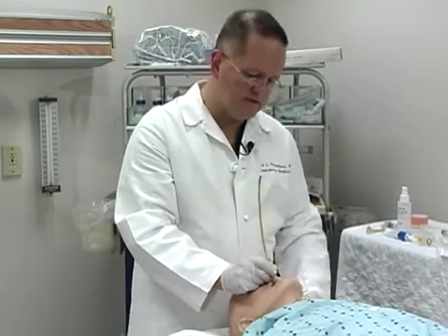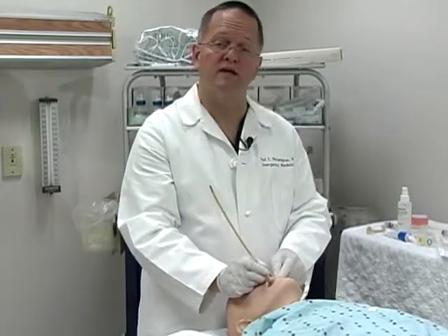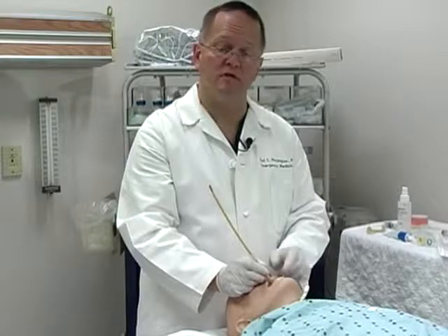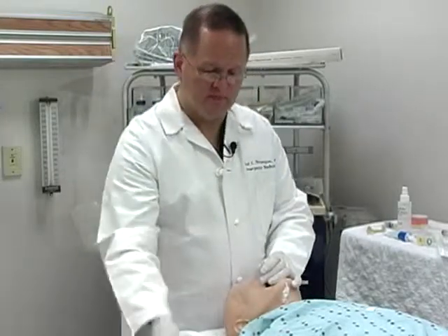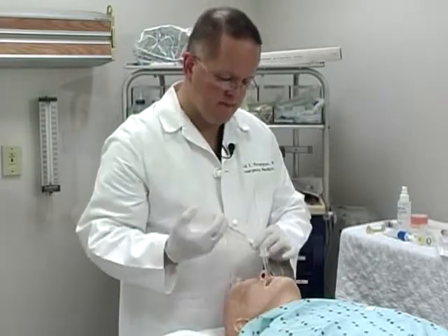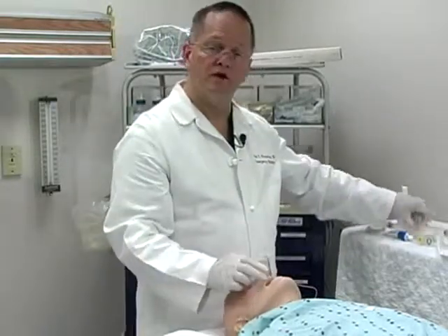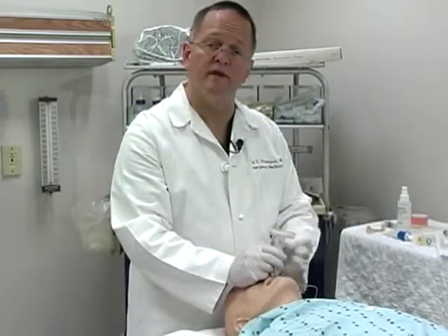Once the tube is in the trachea, make sure that it's somewhere around the 21 or 22 centimeter position for the average adult. Then remove the bougie, inflate the cuff of the endotracheal tube, and begin your confirmation techniques as you would with any other intubation.